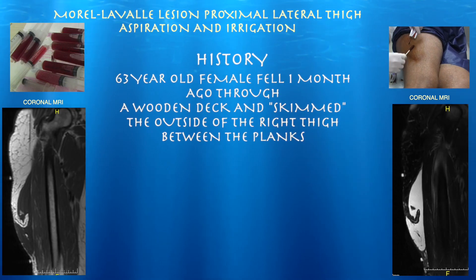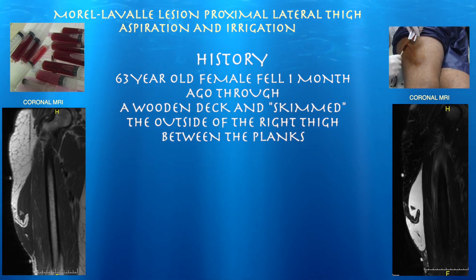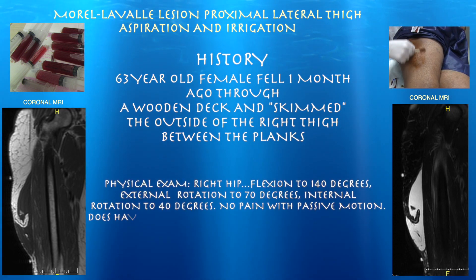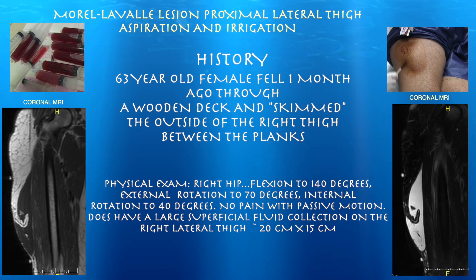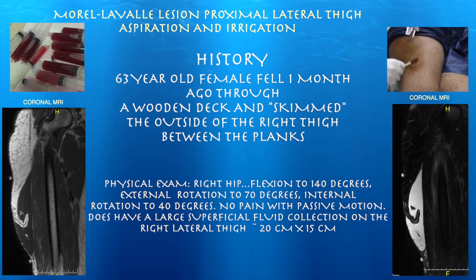This 63-year-old female fell about a month ago and has a huge hematoma on her thigh. We're going to go ahead and drain it and flush it with some saline.